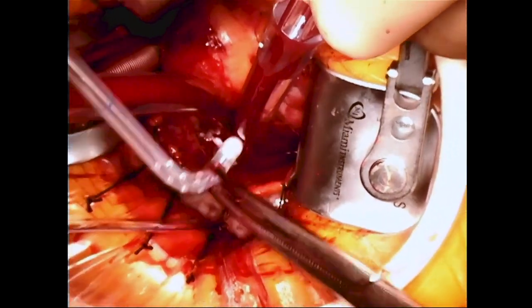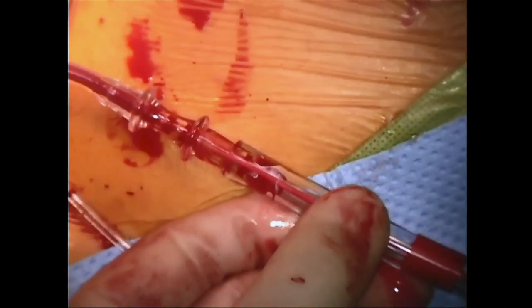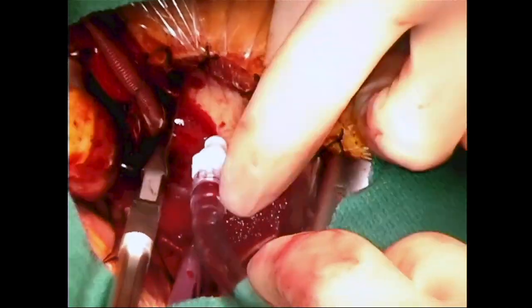One has an excellent view of the right superior pulmonary vein through the incision that has been made, and a left ventricular vent is placed directly through this and secured in place.